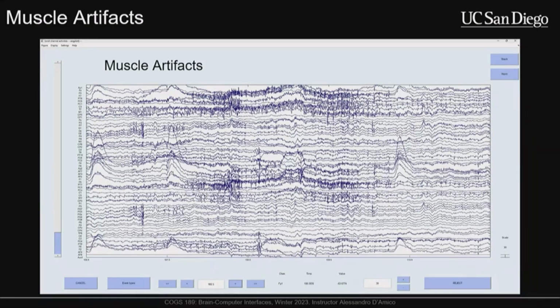Once we start collecting EEG data in the lab, when I train the people who want to get trained to collect that, that's the very first thing that we do once the participant you're working with is capped: you look for the blinks and you have the person clench their jaws. And I've taken EEGs into classrooms with high schoolers and middle schoolers, and they're so excited by the blinks and the jaw stuff. It's ridiculous. They see the raw signals, and as soon as someone starts blinking, they're like, whoa! And then somebody clenches their jaw, and their minds are just blown. Even though for us it's just like, okay, don't do that. But for them, it's crazy that we can do that.